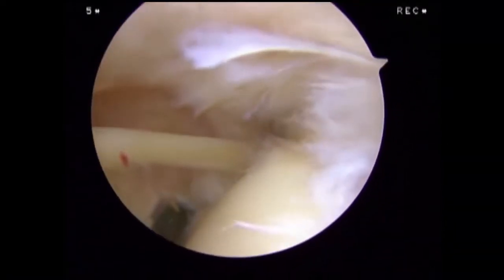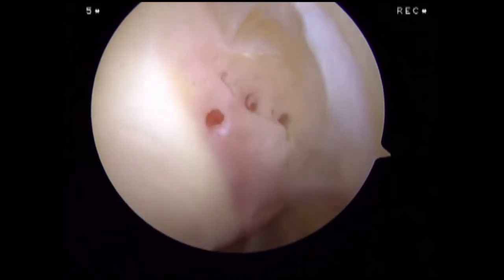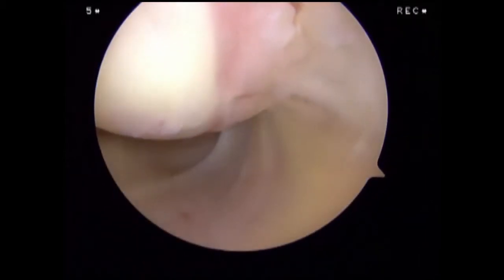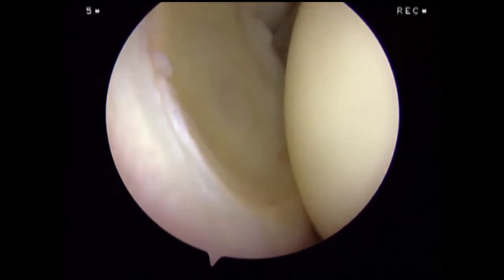We rotate the arthroscope posteriorly and inferiorly to assess the articular surface of the humeral head, including the bare area. Finally, we are able to visualize the capsule and its attachments to the humeral head.